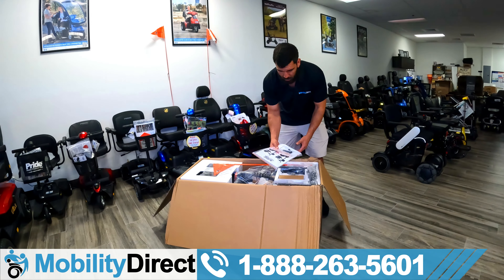So what I'm doing here is taking apart the packaging for the colored panels — I wanted to show you that you can change the colored panels from red to blue, and we'll show you how to do that. Here's the battery box. What's nice about these Buzzaround travel-friendly scooters is you can take the battery box with you and leave your scooter in the trunk of your car. If you're in a hotel, you can bring the battery box up to your hotel room, charge it, and then bring it back down with you — you don't have to bring the whole scooter with you.